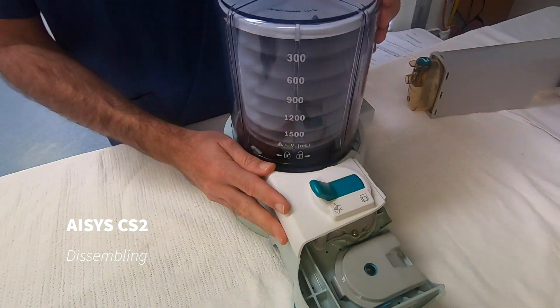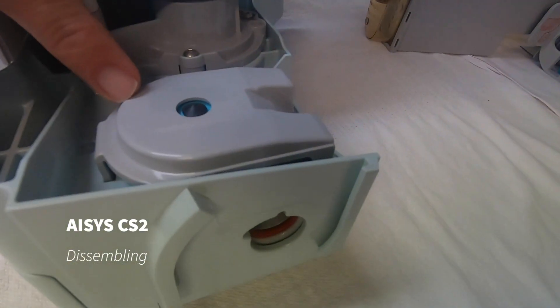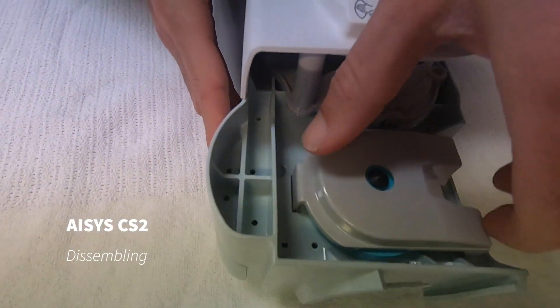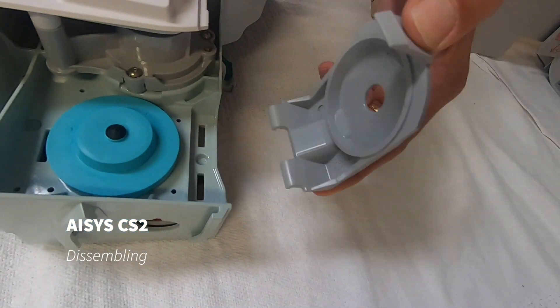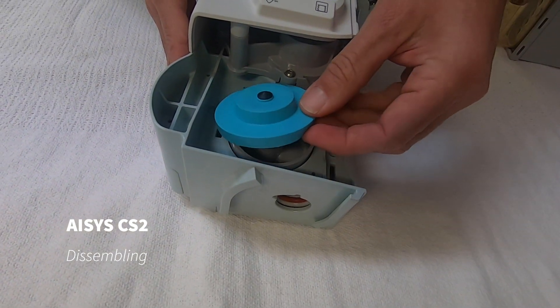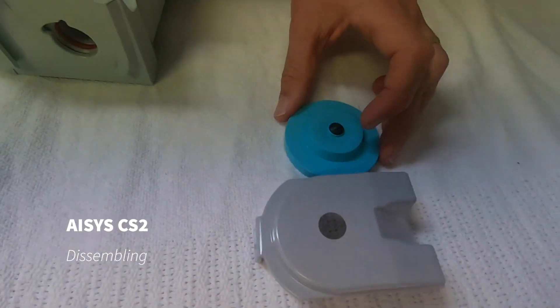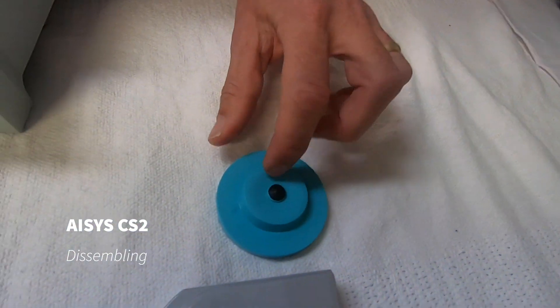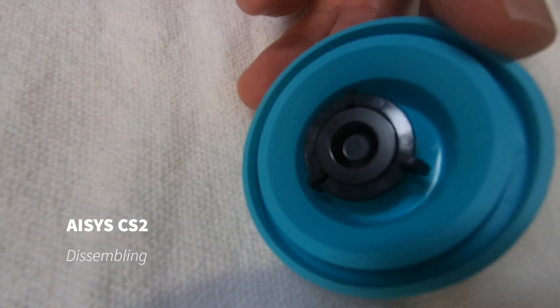We'll continue to disassemble this. We have a ramp which goes over our APL valve. To remove this, we push it in from this side and then the feet lift out last, and the APL valve is removed. There's no need to remove the hard black plastic off the silicon — it's very thin silicon and it will be torn in the process, so there's no need to disassemble that any further.